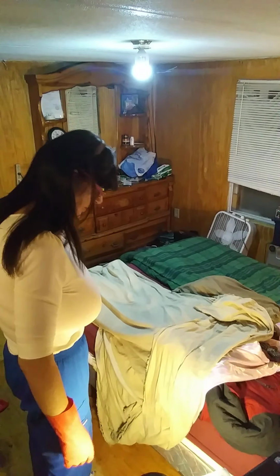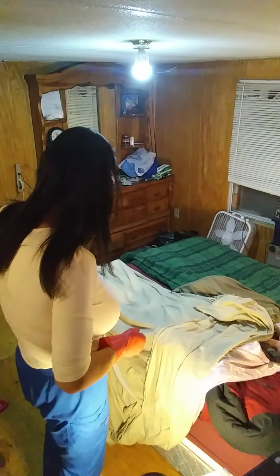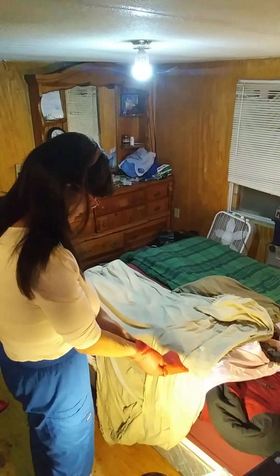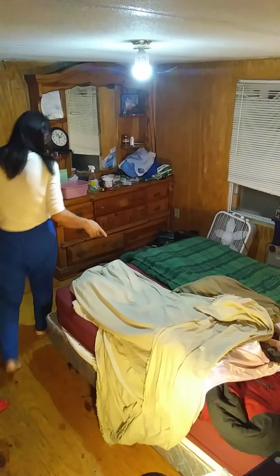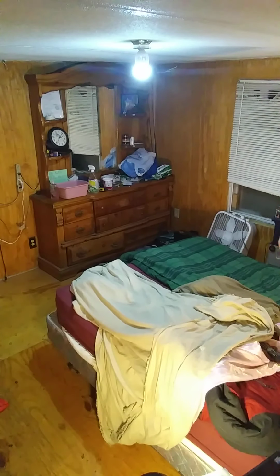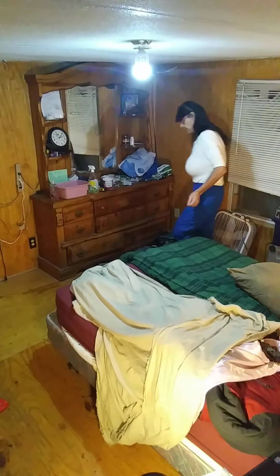Alright, then I'm going to do one more safety check. Make sure the bed is in its lowest safe position. Miss Cheswick has her call light. She's comfortable. I'm going to take my gloves off in a way that I don't infect myself. I'm going to throw them away. I'm going to lower the bed rail on this side because it's not in her care plan to have raised bed rails. I just put it up so that she wouldn't roll out of bed. Okay, for safety.